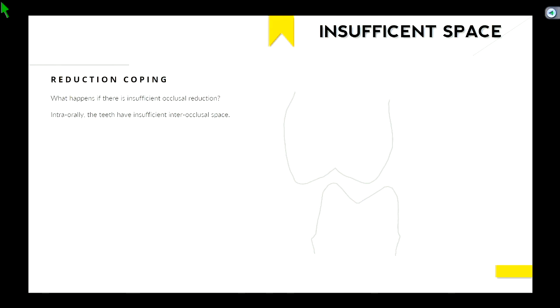You'll see it, yeah. So now you have your patient back in the chair, and then you take off their provisional, and guess what? This is what you see in the patient's mouth. So obviously that space is still under-reduced, right? The patient's mouth hasn't changed. Well, now what you can do is, I want to demonstrate that if you just seated this crown that the lab made and try to seat it onto the patient's tooth, well, it's obviously not going to seat because the inside of the crown looks different than what the patient currently presents with. Because remember, we had ground down part of the stone die, which that crown was made off of.